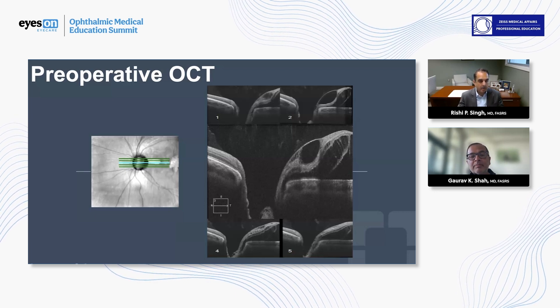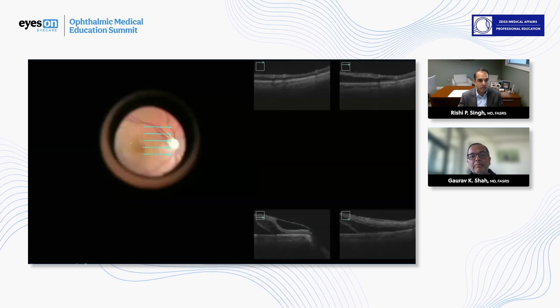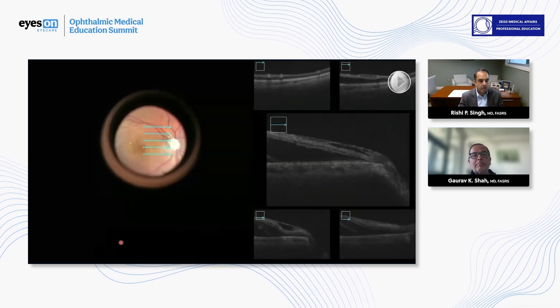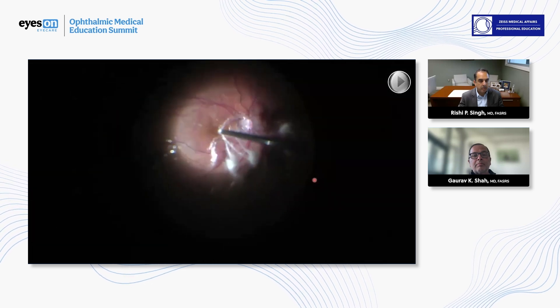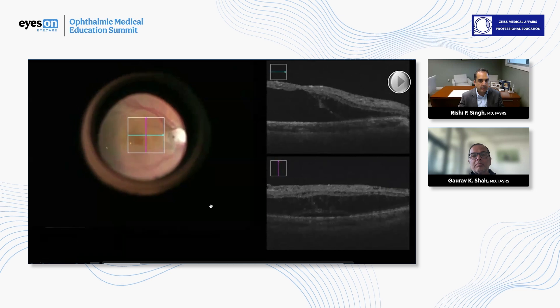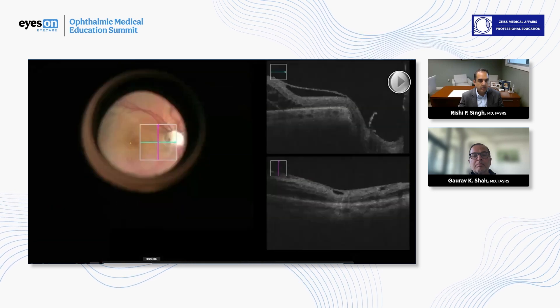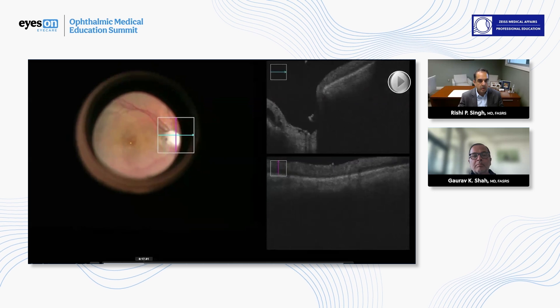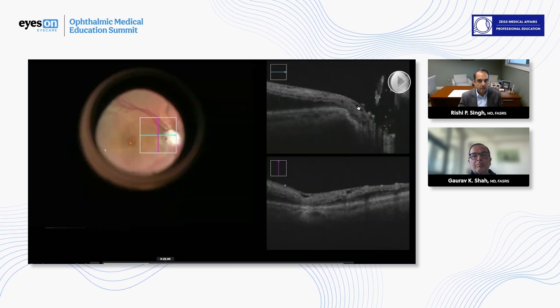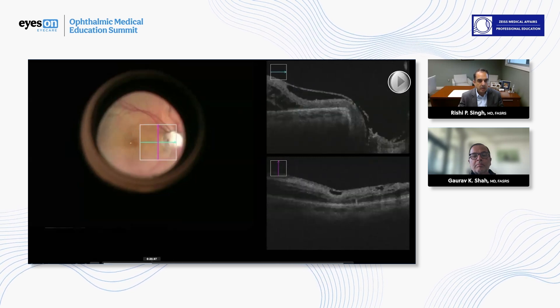That is a great technique. There are very few of these you see in your career. Let's show you the video. You can see the macular detachment very easily. Kenalog is used to assist in hyloid elevation, and I take time to look at the macula — you can see how thin the retina is just above that area. Using the intraoperative OCT, I elevated the hyloid, and you can see right off the bat that the little piece of tissue elevated just at the level of the optic nerve is still there. The line scans show that tissue may be the reason for the tenting there.